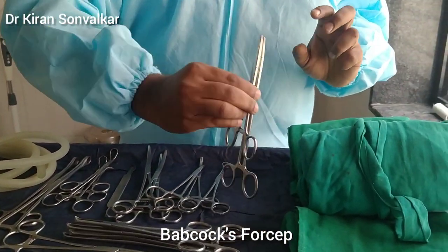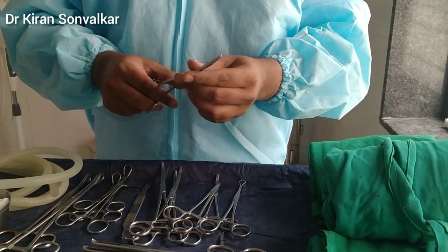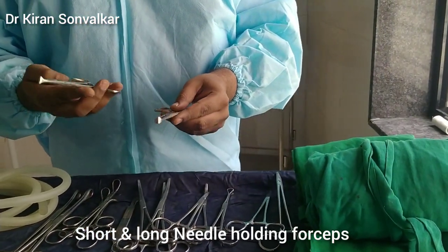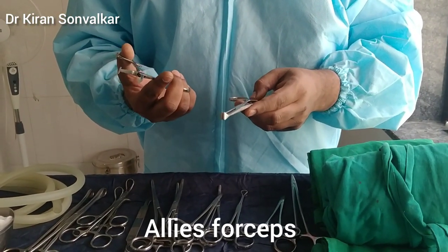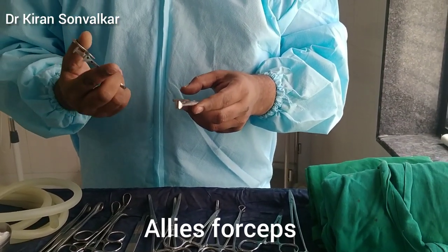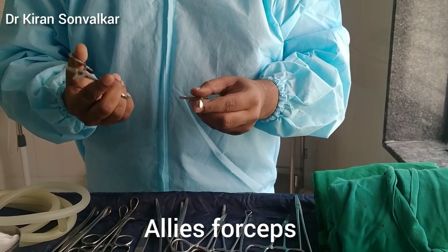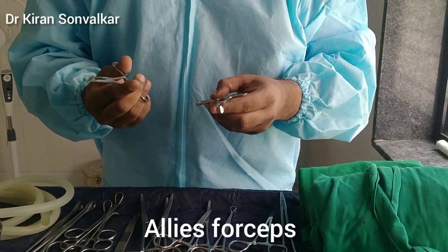These are needle holders, long one and short one, required for suturing. These are short and long Allis forceps. Short and long Allis forceps are required to catch angles of the uterus, to catch the lower uterine and upper uterine segment during suturing. This Allis can also be used for catching angles of the rectus sheath and catching the peritoneum.